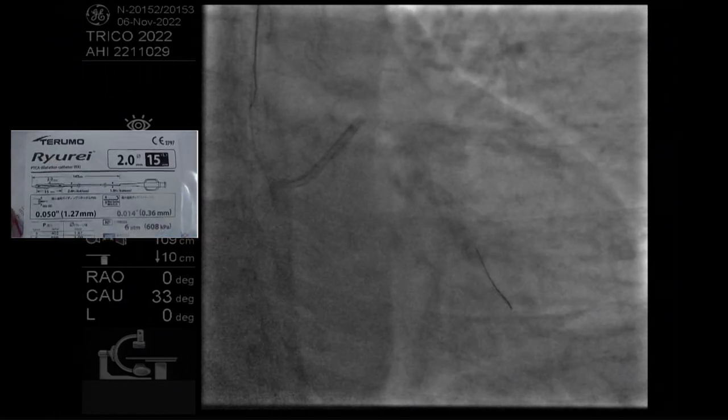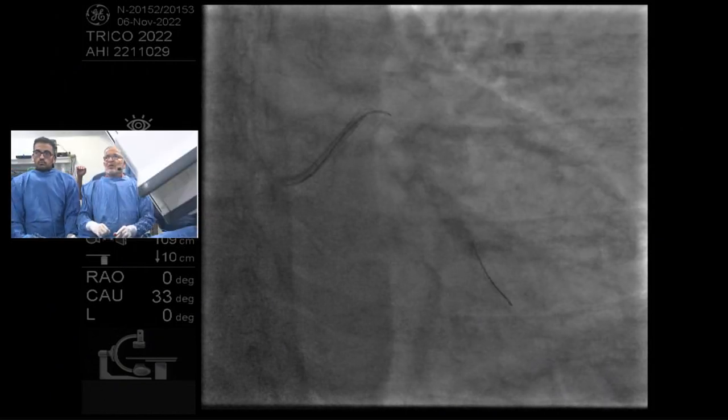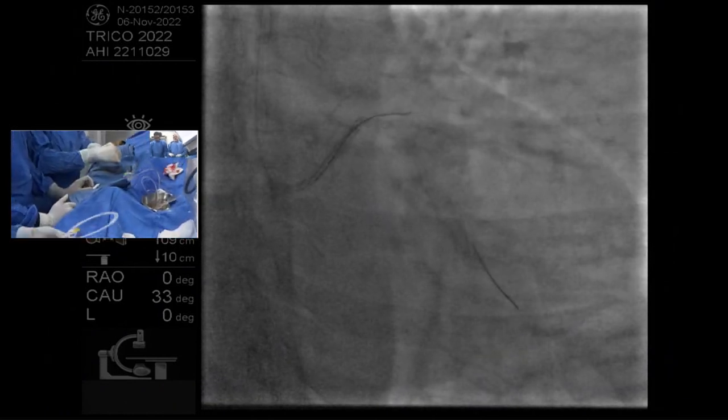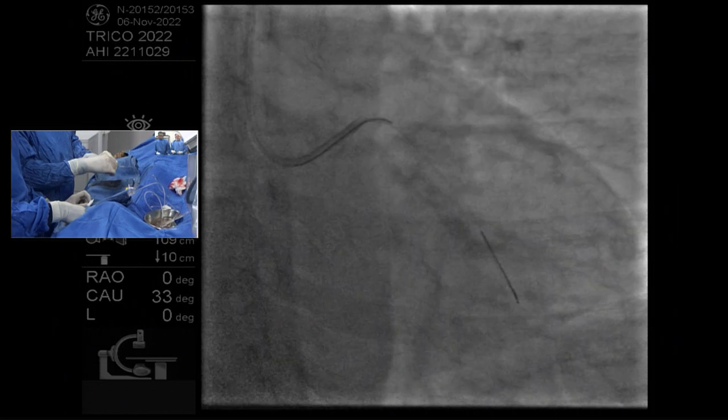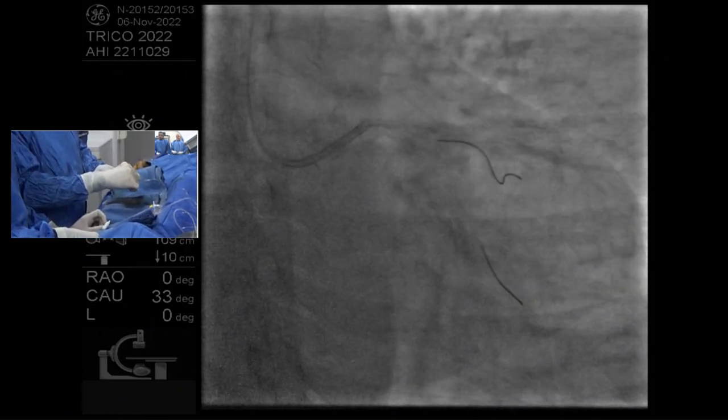And the key, once again, is that you're going to put the wire down the artery, but you're not going to put it super, super distal because you want it to stay on the lesser curvature of the vessel, not the greater. This is the LAD, obviously. So you can potentially... There you go. There. Okay, that's good.